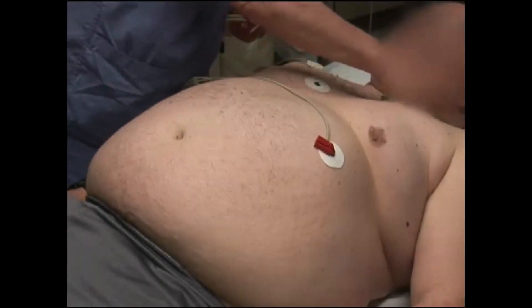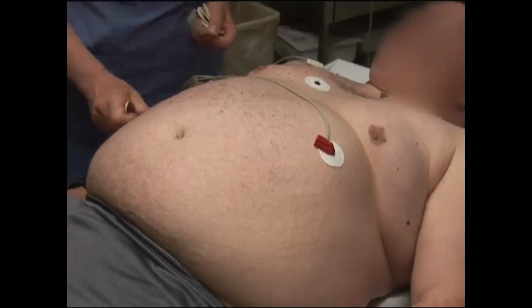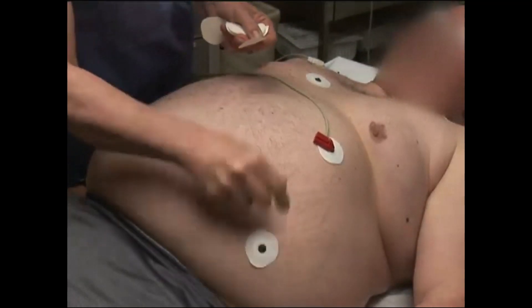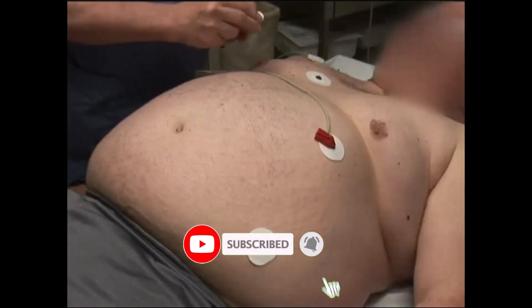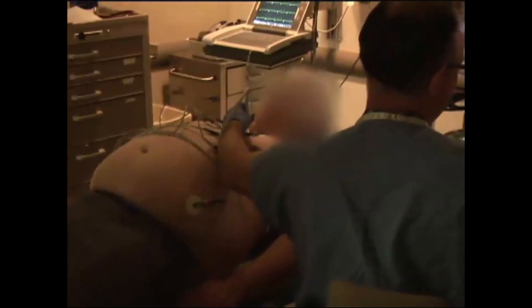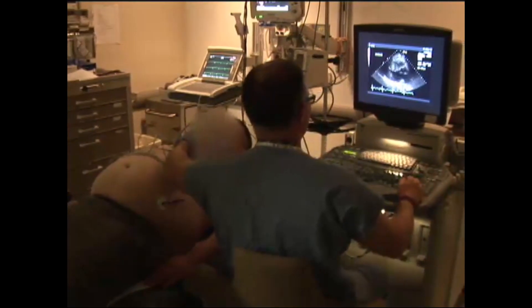The patient lies on the stress echo table in a supine position and the safety belts are attached. Many stress echo beds allow lateral tilt to optimize image quality when needed; this tilt can be stored in memory for use during the stress test. The sonographer then acquires the baseline images and hemodynamic data per study protocol and prior discussion.